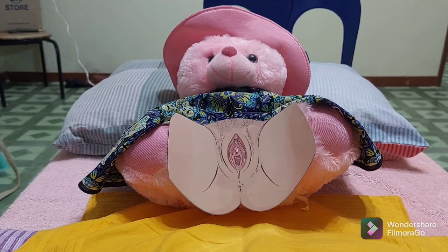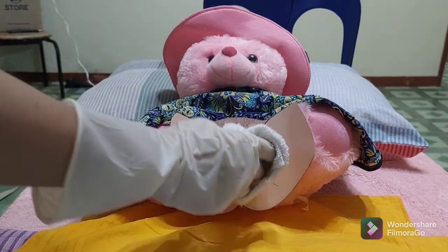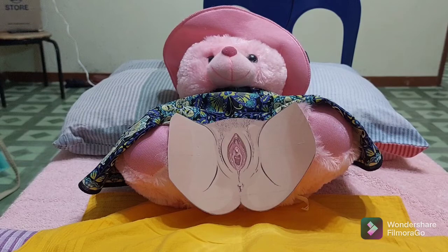After that, I'm going to wipe the labia majora with a new mitted washcloth using the rule of sevens, and then get a new one and wipe the other side. After that, I'm going to clean the middle part using a new washcloth in a downward manner. After that, I'm going to rinse it using the same procedure and dry it.